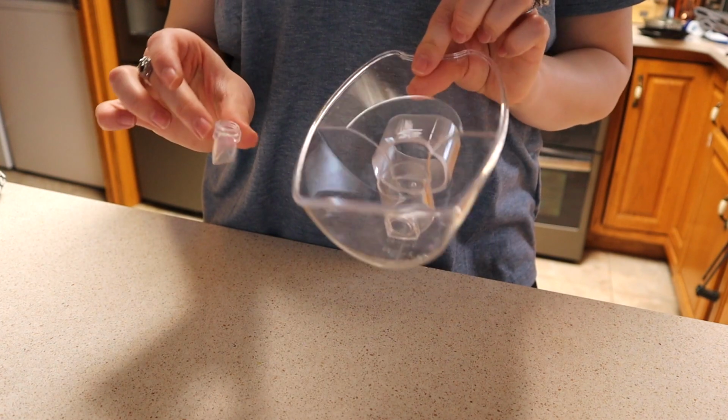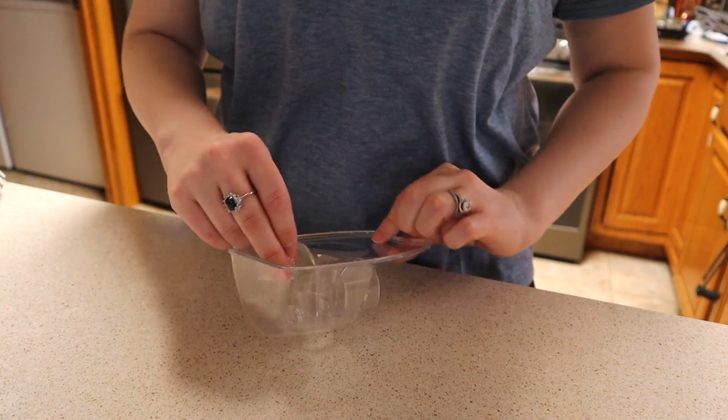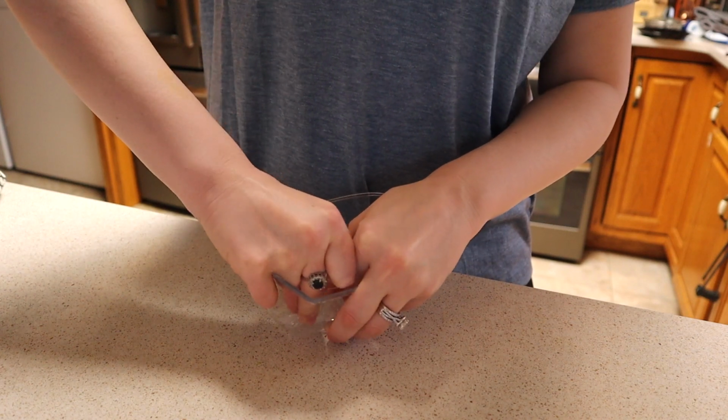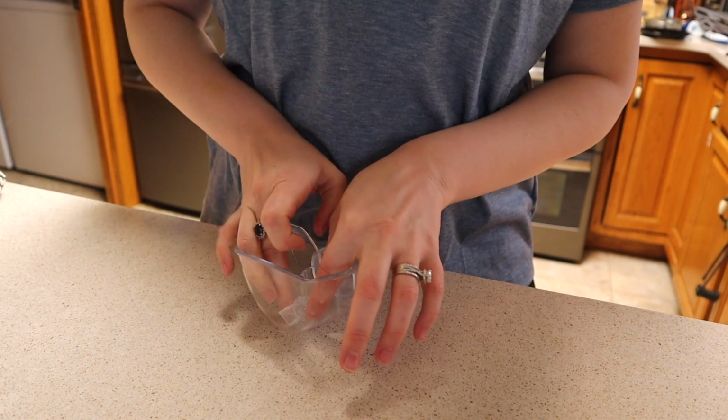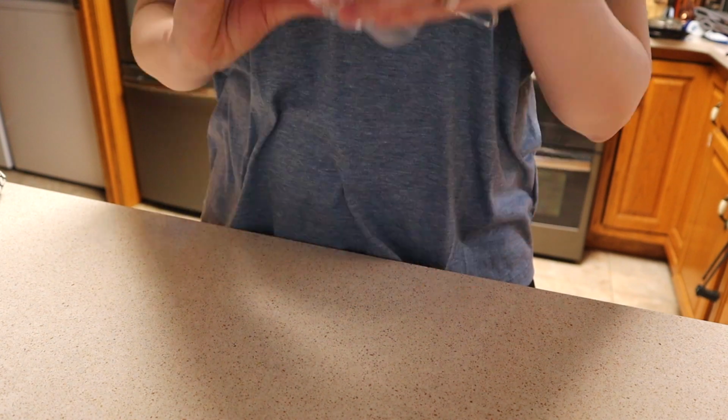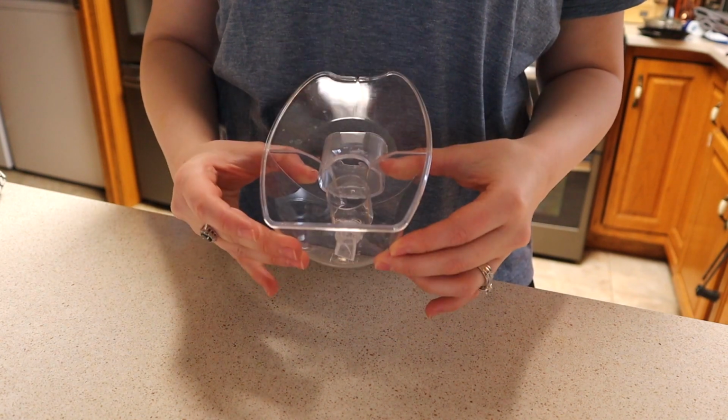Okay, let's talk assembly. These are very easy to use. There's not a lot of parts, but there is one trick I want to be sure to mention. When all your parts are taken apart and cleaned, the first thing you're going to do is put in your valve, and when you put in this valve, you have to pinch it in order to get it in. This sounds hard, but it's really not. Once you get the hang of it, you get really used to it, but you do have to do that little trick in order to easily get it in.